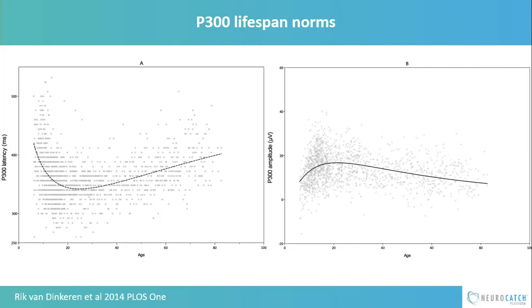So that's a really nice normative thing. And again, I'll reinforce for the P300, you're really looking at the P300 in terms of its measure of your information processing. And the key thing about that is it's like blood pressure with white coat syndrome. It can be variable. So individuals can vary, particularly depending on their current state when you're seeing them. If they're well rested, they've had a good sleep, and they're feeling awake and alert, they will give you a very good P300. And if they were out partying the night before and haven't had coffee, it will change.